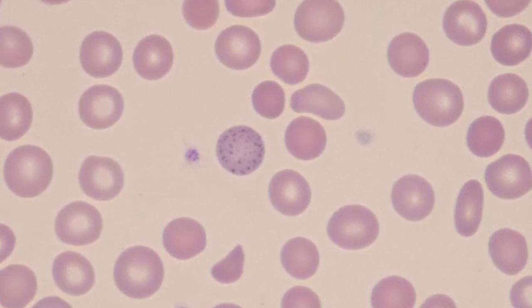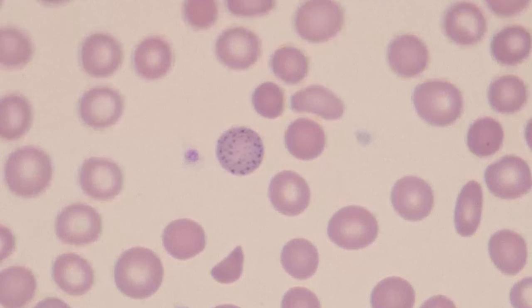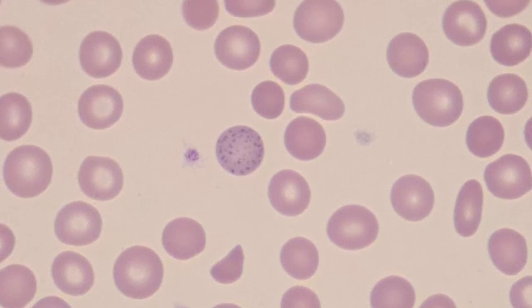Now, Howell-Jolly bodies would be very easy to differentiate because usually Howell-Jolly bodies are just one. But as we can see here with this basophilic stippling, they're all over the place. And usually Howell-Jolly bodies are much bigger than the basophilic stippling granules.